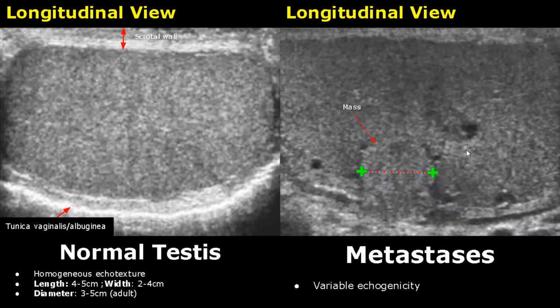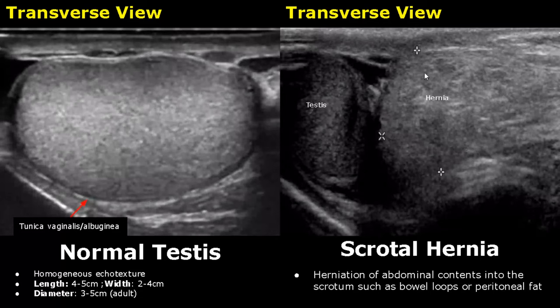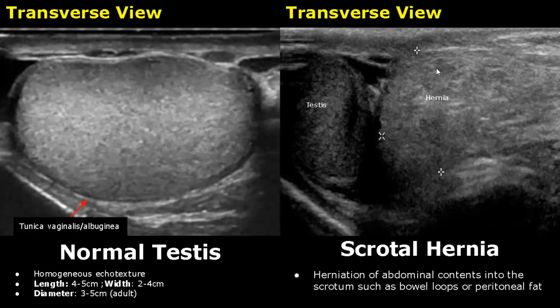Here is an image of scrotal hernia — there is herniation of abdominal contents into the scrotal sac. Usually peritoneal fat or bowel loops are herniated. Here we see peritoneal fat next to the testis in the scrotal sac.